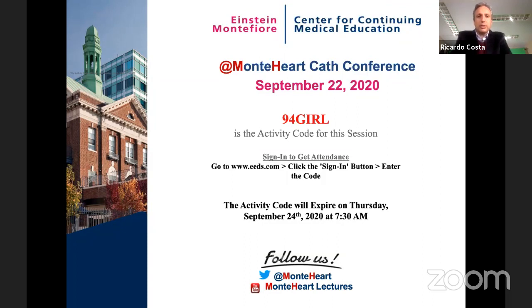So this, of course, was completely unacceptable. And also, the technique has much evolved from that time to this time. Why was crush so widely accepted in our community? Because somewhat it guarantees a patency of the side branch with a modified T technique. So you would cover completely the ostium of the side branch, and then you could work, let's say, without the risk of losing the side branch.